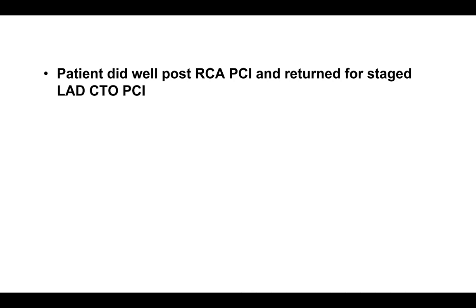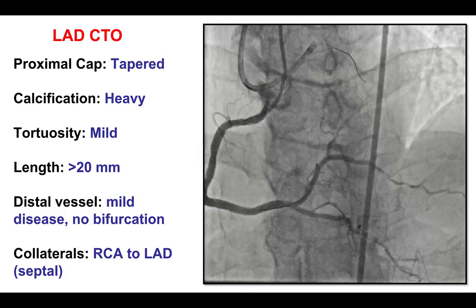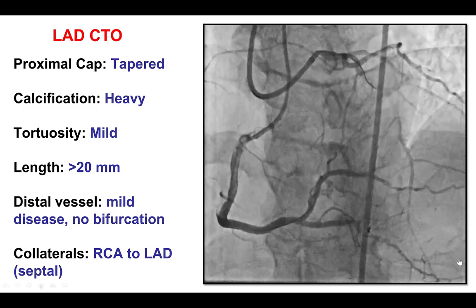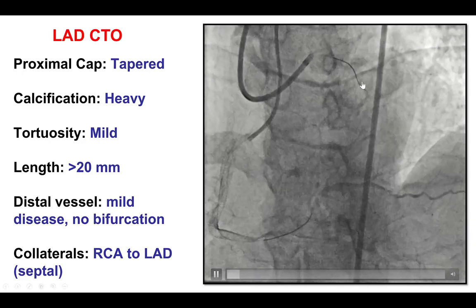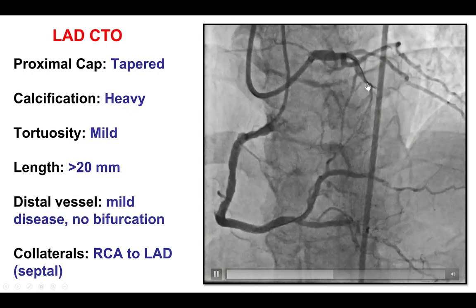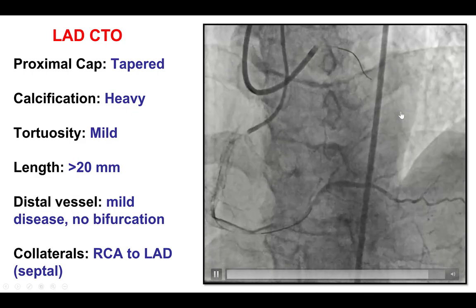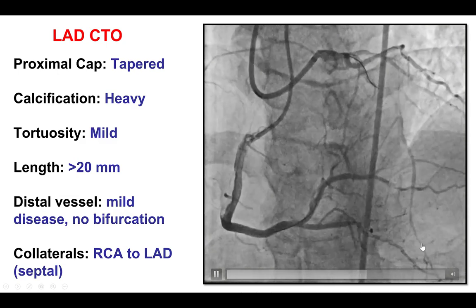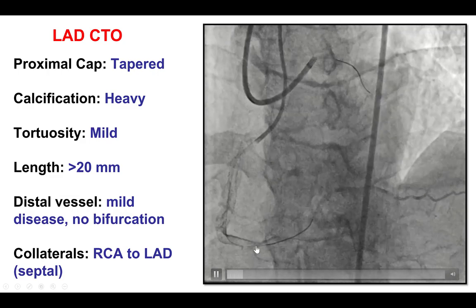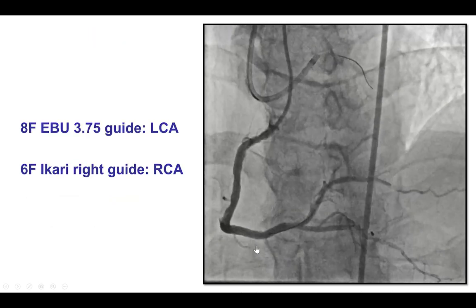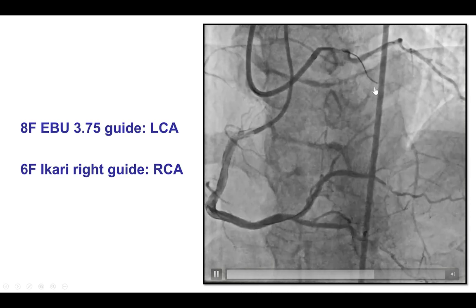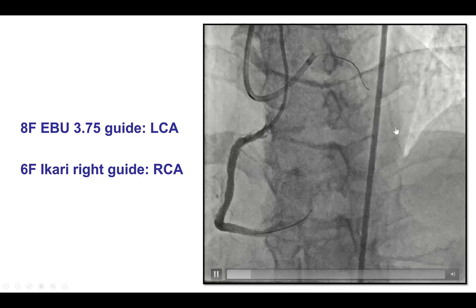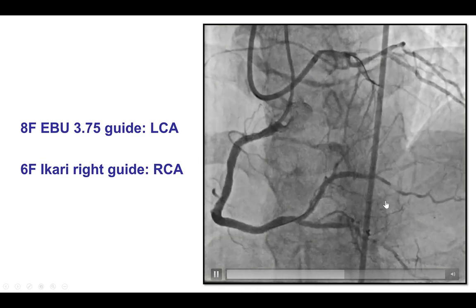The patient did well after the procedure and was subsequently referred for staged PCI of the LAD chronic total occlusion. This is the dual injection demonstrating a well-defined tapered proximal cap with approximately 30 to 40 mm lesion length. The distal vessel is patent and is filling via both epicardial as well as septal collaterals from the right coronary artery. The plan was to first perform an antegrade wiring attempt, followed by ADR if we became subintimal, followed by retrograde if that failed.